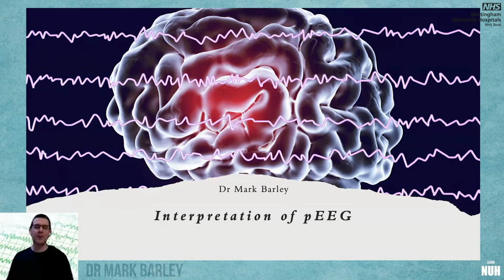One of the messages that I've been trying to communicate to colleagues through SIVA and the association is that there's a lot more to EEG interpretation than just these numbers that the processed EEG monitor produces. If we think about the monitors that we use every day in clinical practice, we see our SATS probes fall off, we see overdamped arterial lines, and we see artifacts on the ECG. And we always refer back to the trace to confirm or refute any mysterious reading. And EEG is no different.